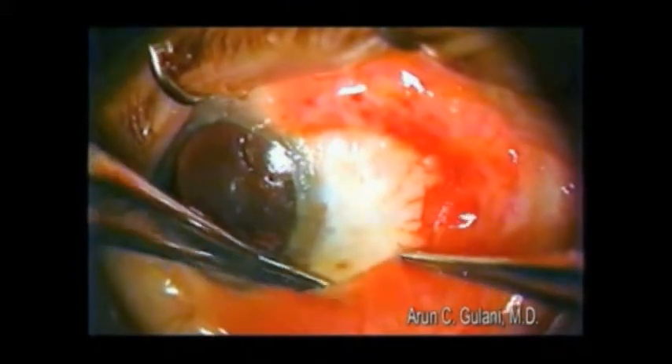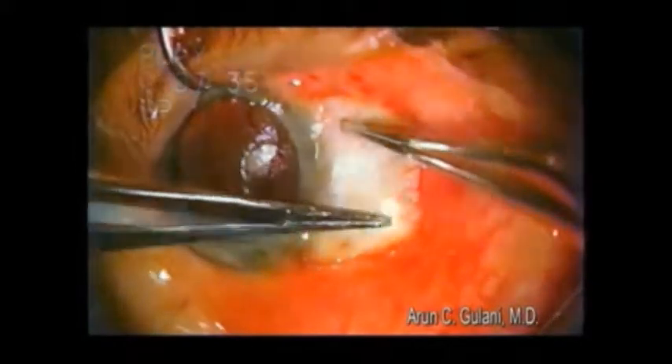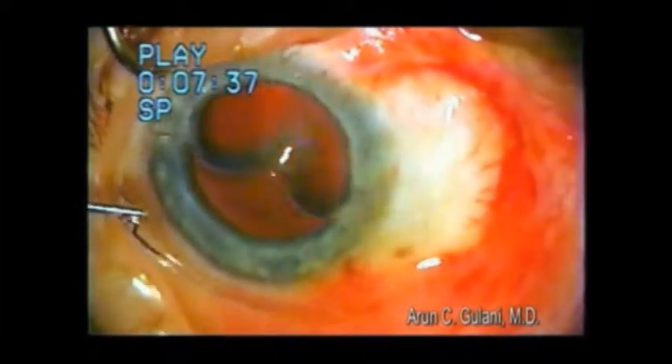We can also arrange the conjunctiva for next day appearance in such cases to make sure we get a great cosmetic outcome, followed by a bandage lens.